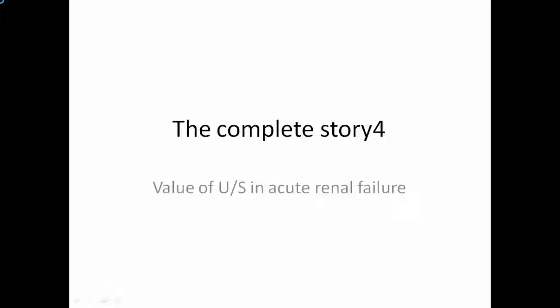So pleased to be with you now for the complete story 4. In complete story 4, we will talk about a very important topic in critically ill patients, which is the value of ultrasound in acute renal failure.